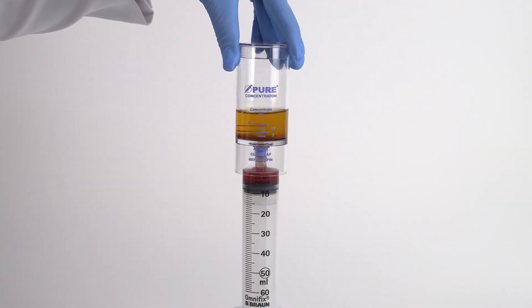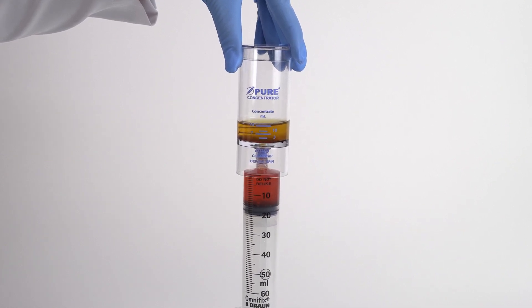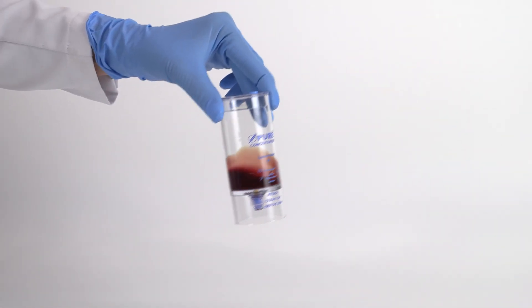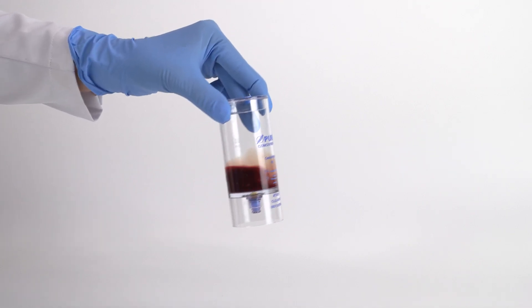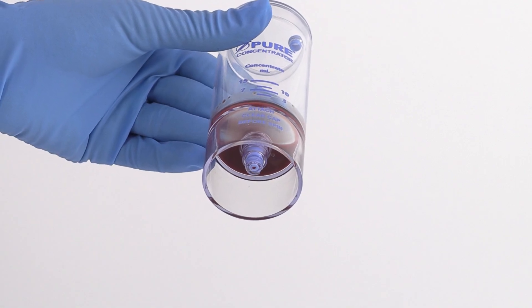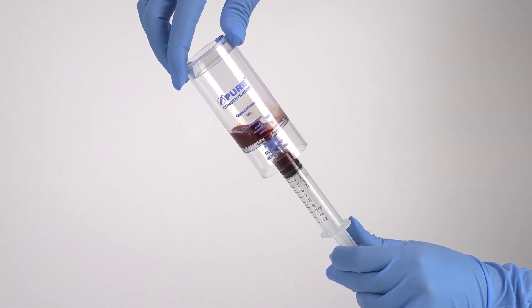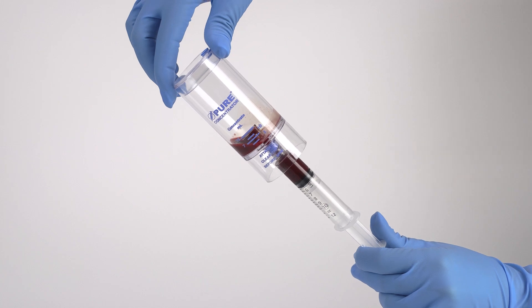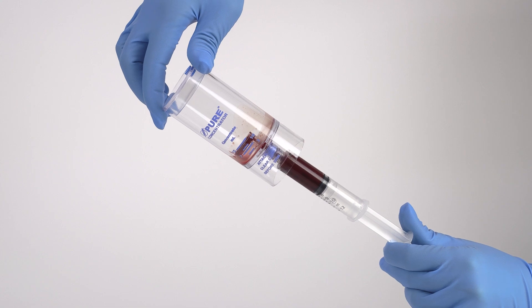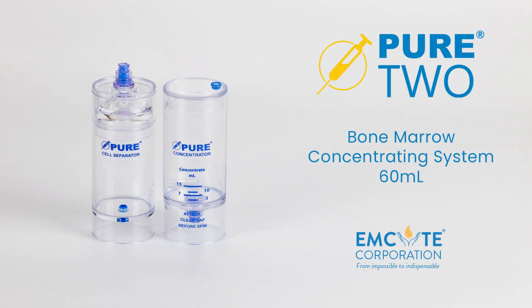Attach a sterile syringe to the needleless port and aspirate the bone marrow plasma, leaving 7 milliliters of solution in the device. Resuspend the cell concentrate back into the plasma by rocking and swirling the device back and forth until all of the concentrate has been resuspended into the plasma and is no longer visible at the bottom of the device. Attach the 12 milliliter syringe to the needleless port and tilt the device to aspirate the bone marrow concentrate. This concludes our processing video for mSight's Pure BMC2 concentrating system.